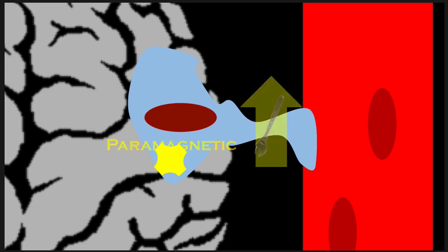I think about it sort of like oozing and spreading around, something like this. And now it's less concentrated. So it's more homogeneous, and therefore there's less T2 star effect. So you're going to start to see the signal become brighter on T2 again. Now, the molecule itself is intact, still with those 5 unpaired electrons, still allowing that inner sphere bonding of water.